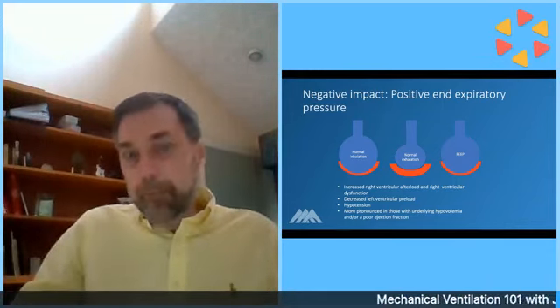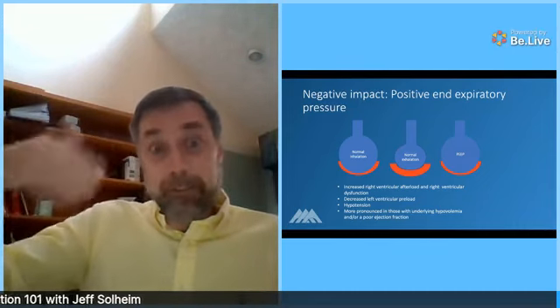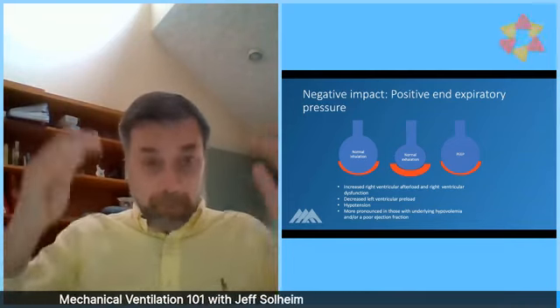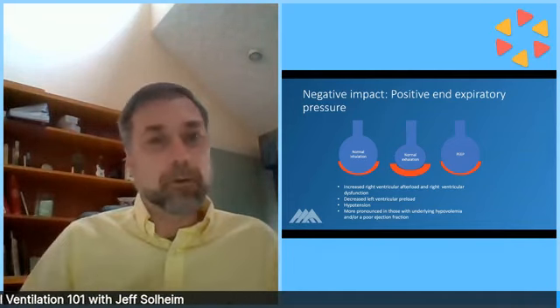Now, on the CO2 side of things, again, you can increase the tidal volume as you need to have the patient blow off more CO2. You can increase the respiratory rate to whatever, 20, 22, whatever you think you can manage, and get that PCO2 down to normal. And then when it normalizes, you can bring those values back down to normal.